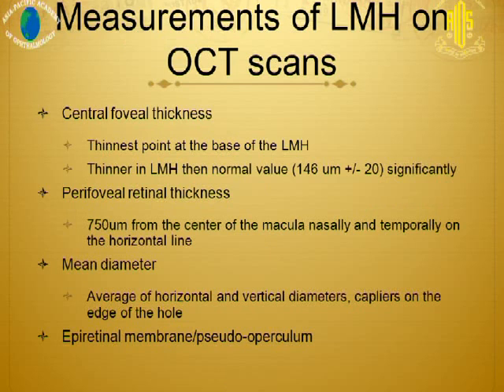With OCT, you can measure the lamellar hole using calipers in the software. You can measure the central foveal thickness at the thinnest point at the base of the lamellar hole. The perifoveal retinal thickness is measured nasally and temporally from the center of the macula on the horizontal line, and the mean diameter is measured horizontally and vertically with calipers placed on the edge of the hole. An epiretinal membrane or pseudo-operculum can also be identified. These measurements allow unified study of lamellar hole progression.